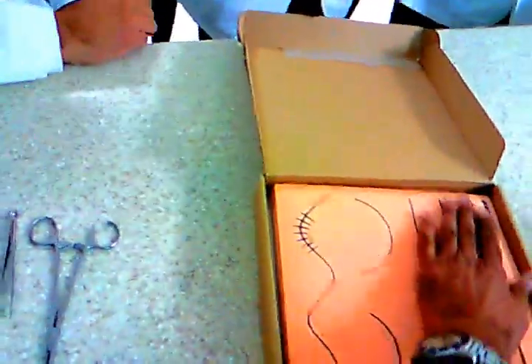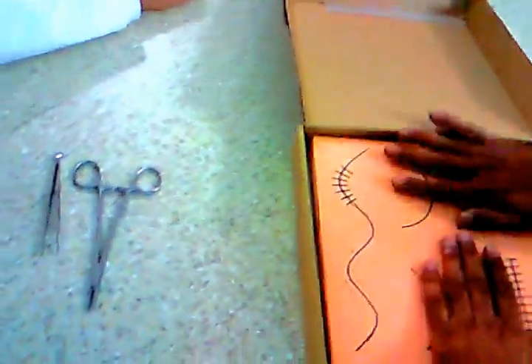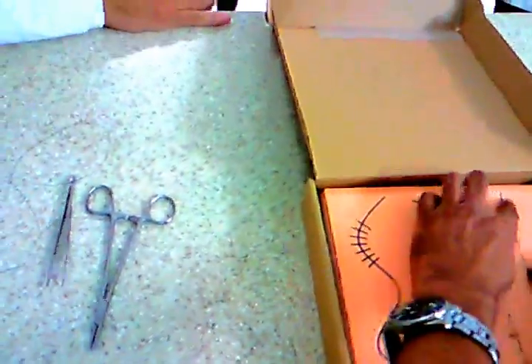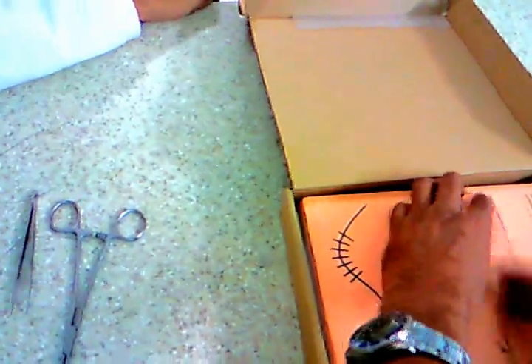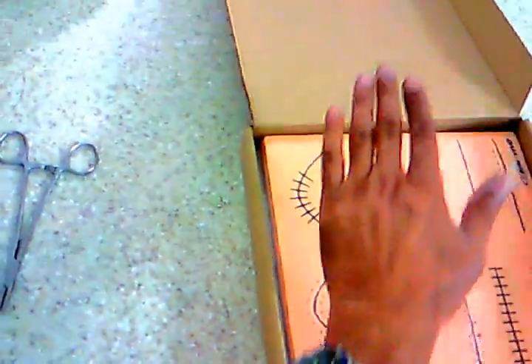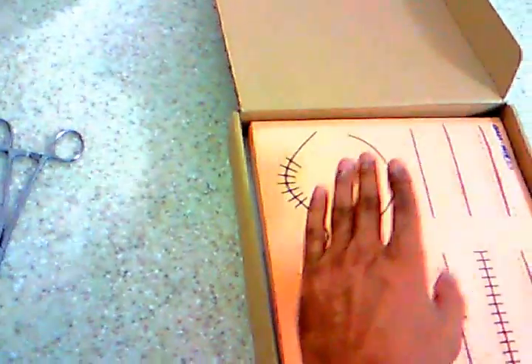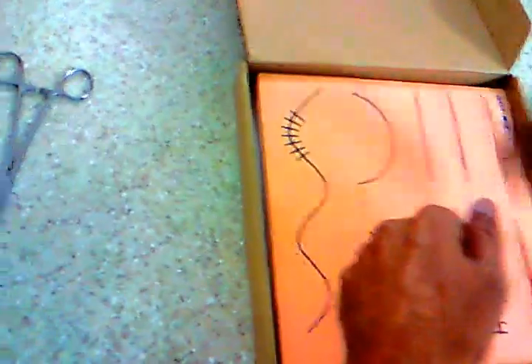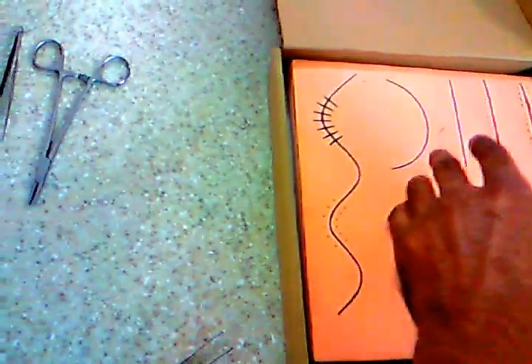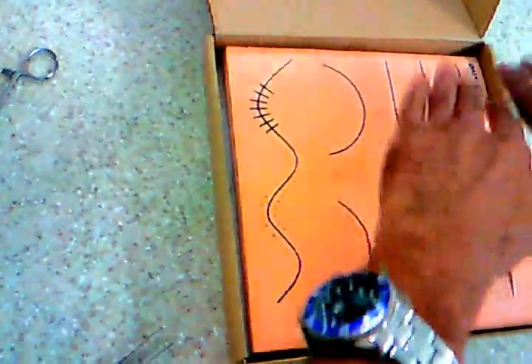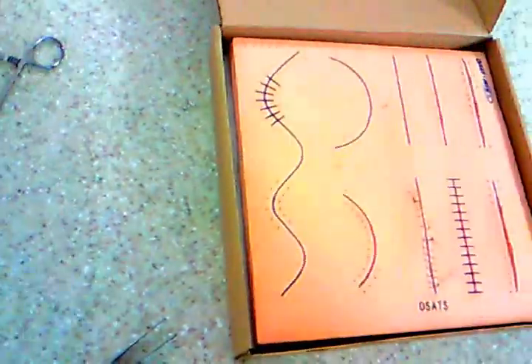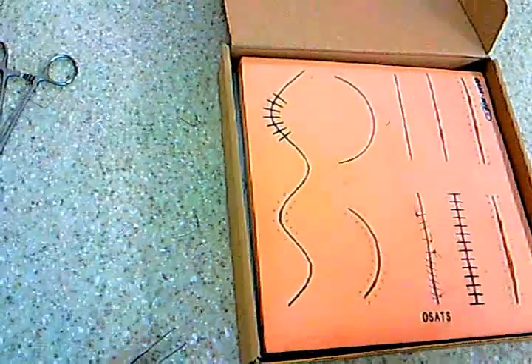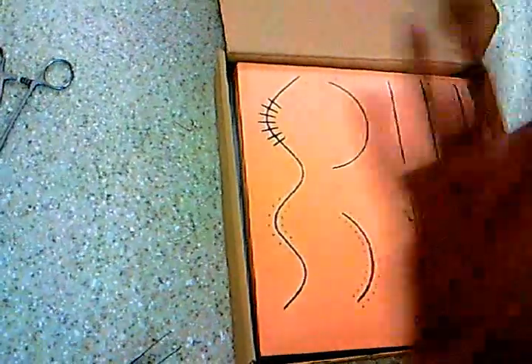I'm just clearing up the way for the vertical mattress. What I forgot to mention was when you're doing suturing, it's taken for granted that you've done the cleaning and draping. It's all mentioned in the last slides - chlorhexidine, isopropyl alcohol, povidone iodine, draping, gloves, putting the gloves like that and all those things are taken care of.